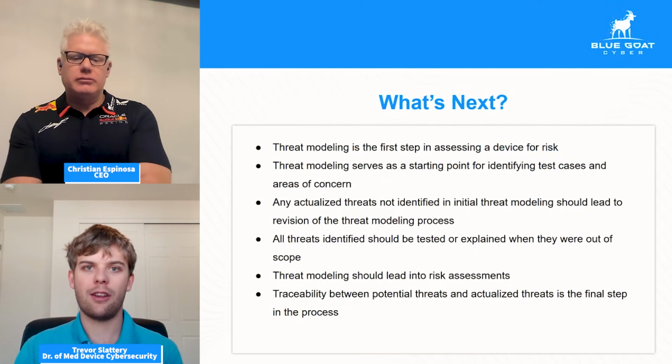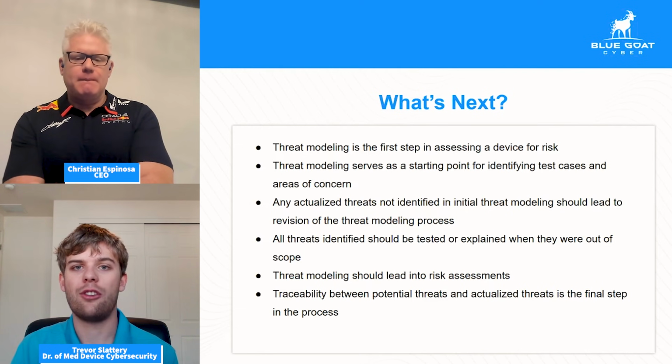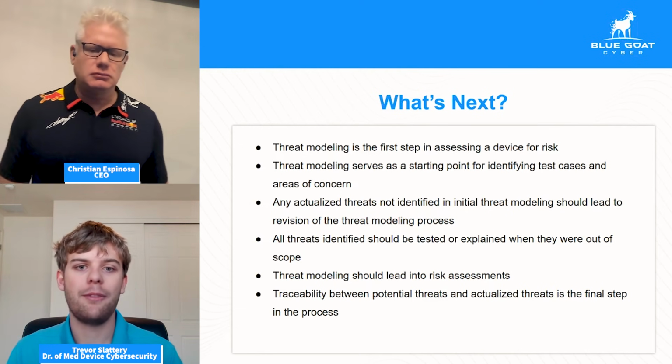The FDA explicitly calls out the total product lifecycle, development environment, and security considerations early on as some of the most important steps to take when designing a device. So making sure that threat modeling is done early and often is very important.